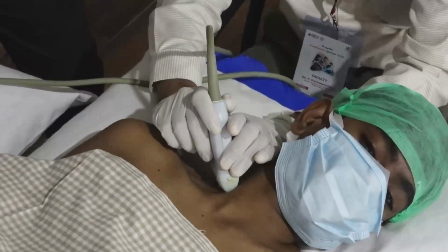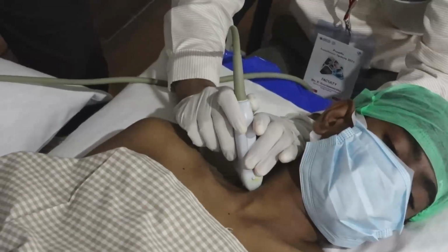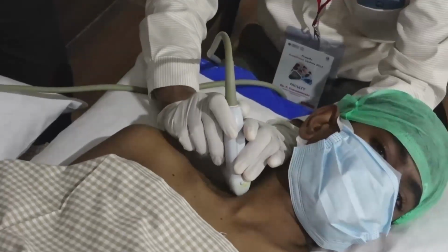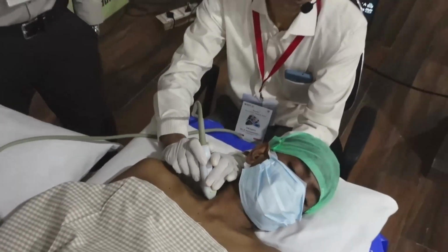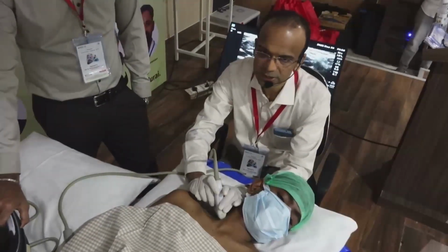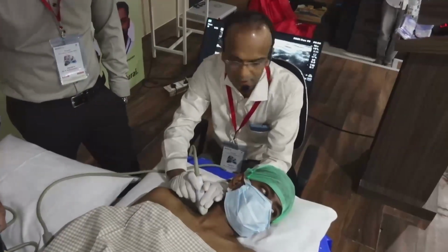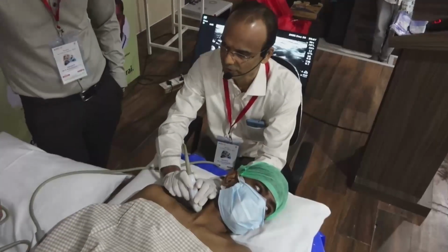There are some specific features to identify C5, C6, C7. Everywhere you have to look for the transverse process appearance to find out the level. C7 has a unique sonomorphology, C5 has a unique sonomorphology, and even C6 has a unique sonomorphology.